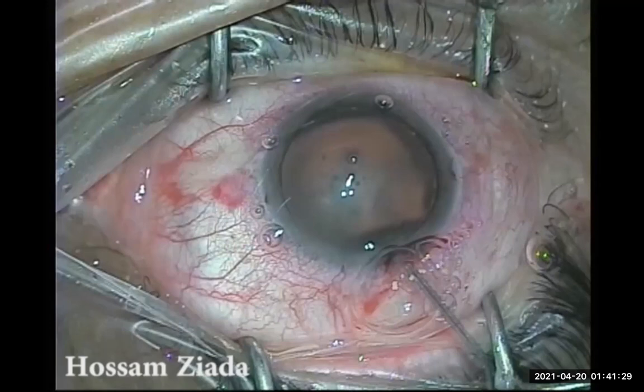The fundus could be seen only with great difficulty, but I could see it appeared to be a good fundus. There was no problem with the disc or the macula, though the disc was somewhat swollen, likely due to the elevated intraocular pressure over time. There was no abnormality in the anterior segment, and the lens was swollen and large, making the intraocular pressure very high and the anterior chamber very shallow.